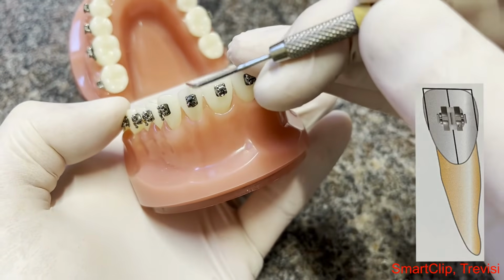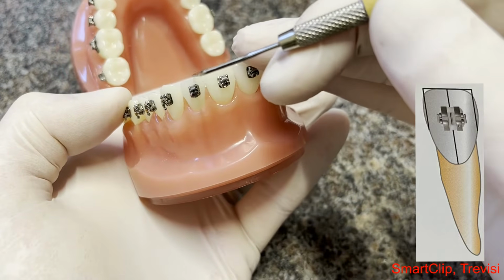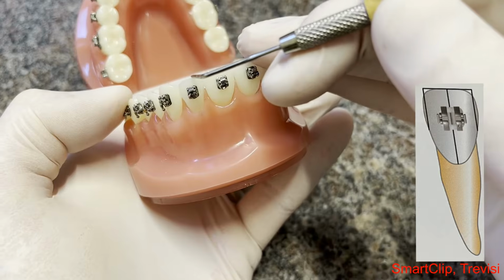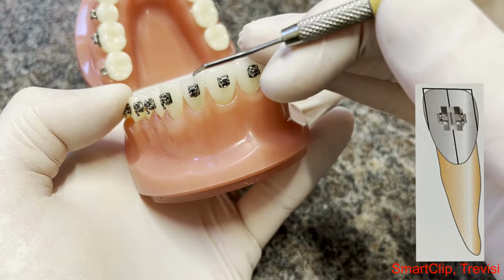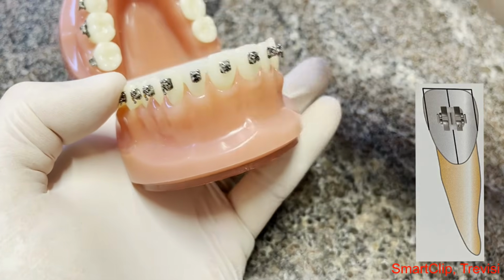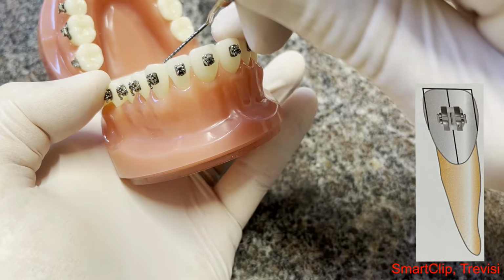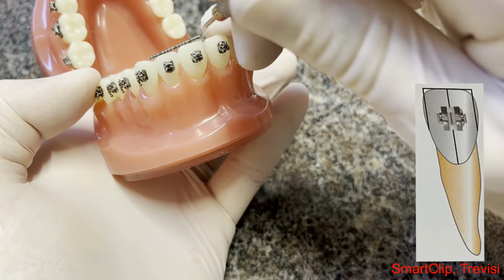Do not look at the incisal edge and set it perpendicular to this incisal edge, because most people have wear and tear or different shape anomalies on the edges of the teeth, so their edge could be like this, at that angle, which is not perpendicular to the long axis of the tooth. So when we're done, I'll polish that down nice and level.